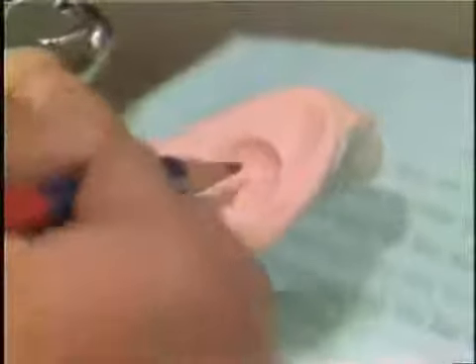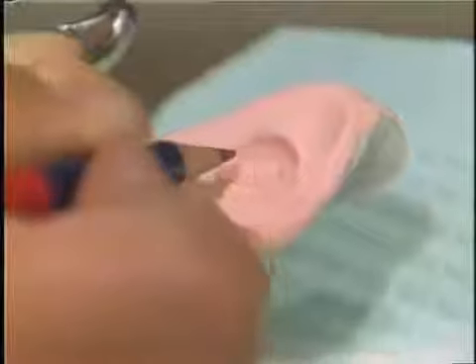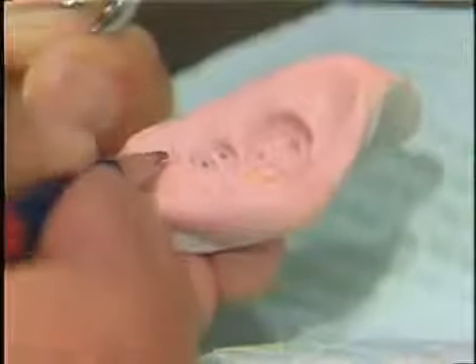We're going to mark then the supporting cusp areas with this pencil. These are the lingual of the maxillary teeth. This bicuspid area does have a double cuspid pontic. It's a bridge opposing.